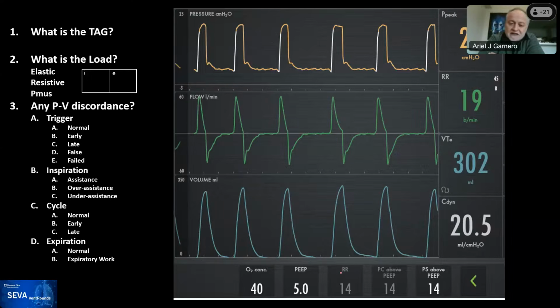But the specific thing of auto mode that wasn't mentioned even in the manual is that maximum apnea time is awarded after the patient produces 10 spontaneous breaths, and they are counted by the machine. In theory, if you become apneic after one spontaneous breath, the apnea time is going to be slightly larger than the cycle time.